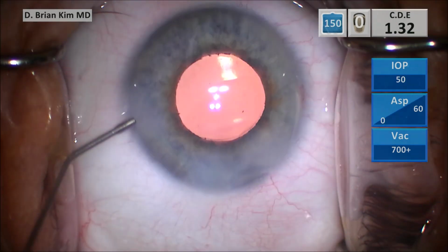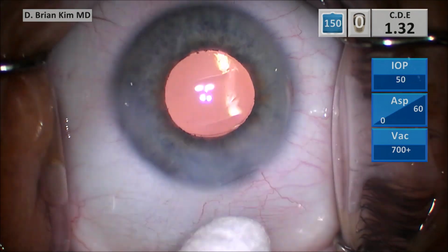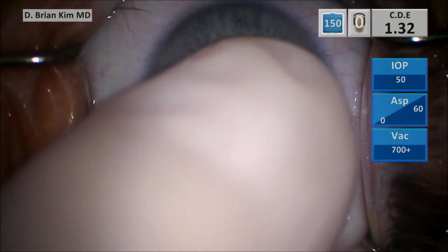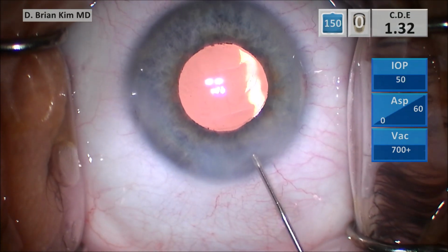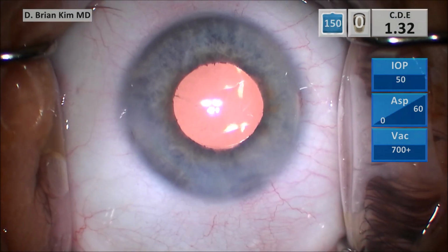By doing lens disassembly this way, using mechanical fracturing forces and using the chopper and the phaco tip to separate the lens pieces rather than using high ultrasonic energy, this is a much more controlled and safe, in my opinion, a better way to disassemble the sticky lens.